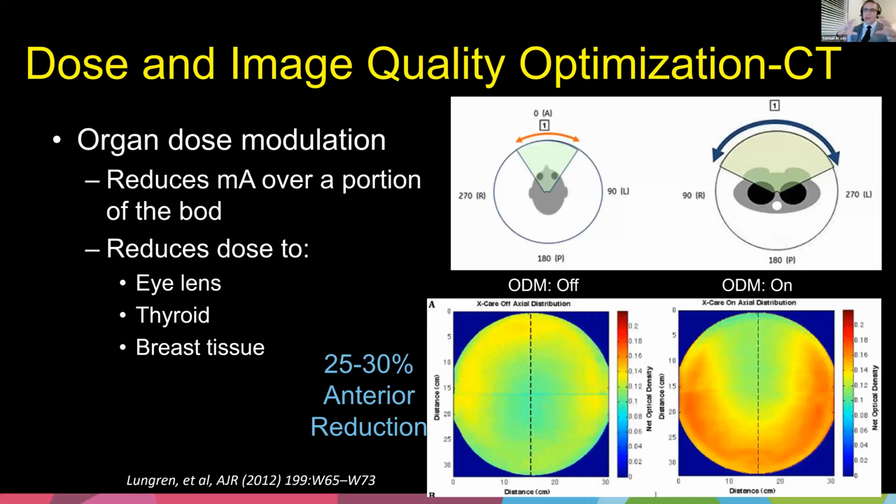Now, in our Radiometrics system, we have an alert level, and then we have a really big alert level in case something crazy happened, like the patient got scanned two, three, four times. In those cases, the system will immediately email me and a couple other people and say, hey, by the way, this dose was like 300% higher than it normally should be.